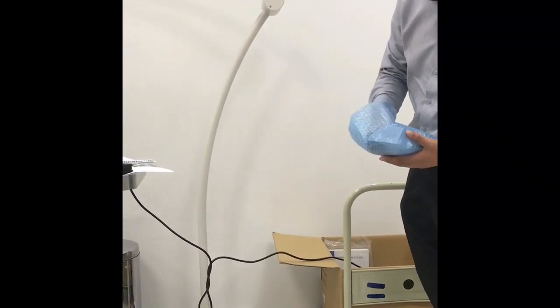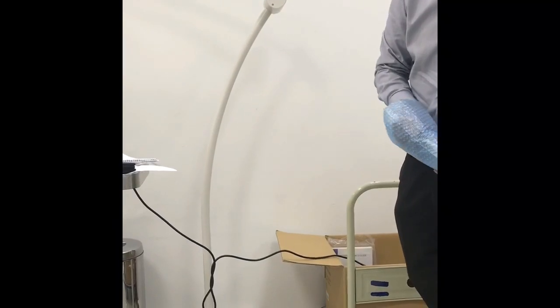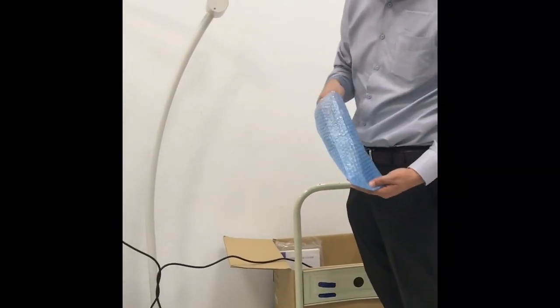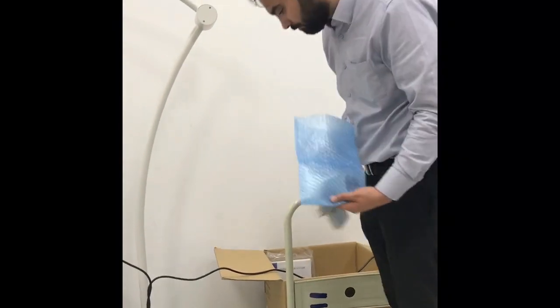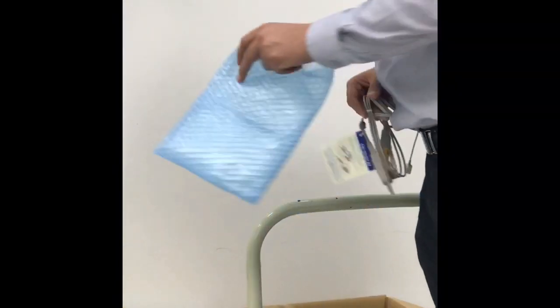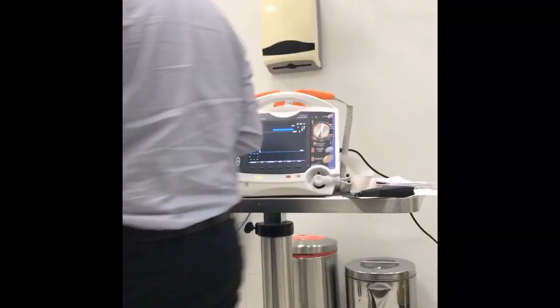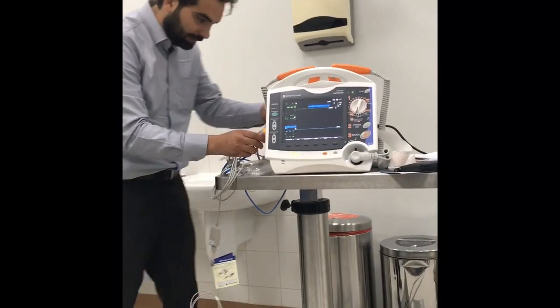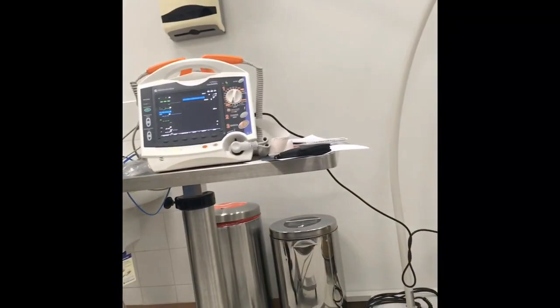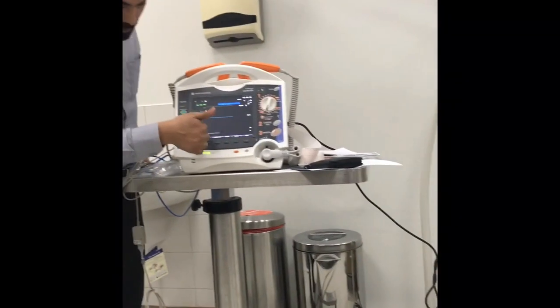You can even connect invasive blood pressure to the machine. So in case you are in the OT and you need to connect this to the patient, you can still connect it, and you have the full parameters that the doctor needs. Okay, so even the ETCO2 is here. We just have to plug it in. Once I plug it in, the machine will recognize automatically that there is ETCO2.